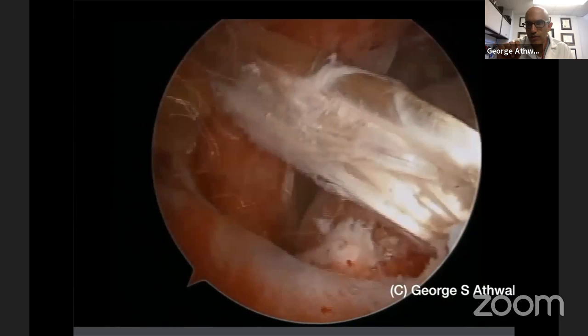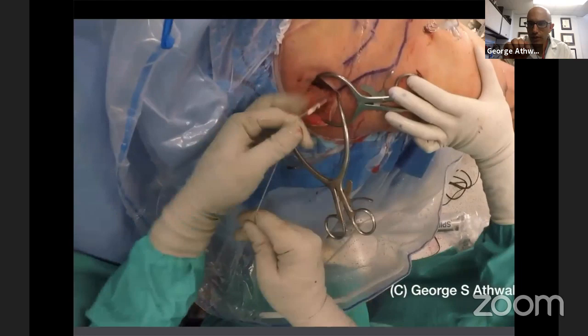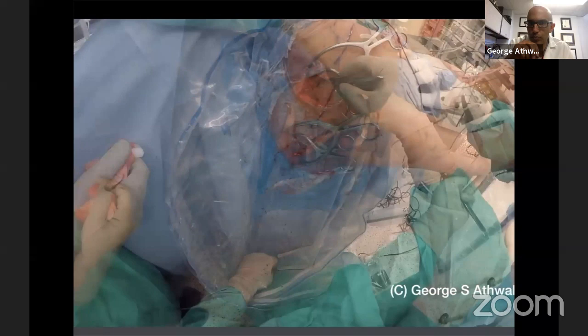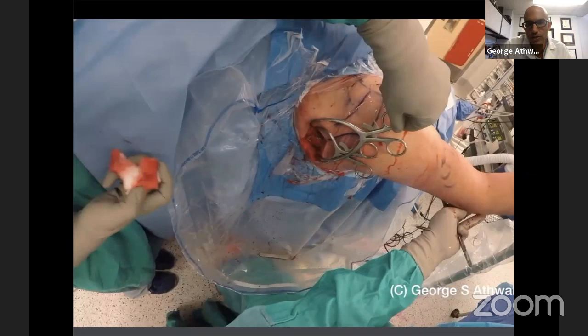And so now what I'll do with the free limb of the graft is tension that and pull on that, place the arm into maximal external rotation and abduction, and secure the free limb back to the lower trapezius. So I've got a looped reconstruction. There you can see the graft right there. So that's the lower trapezius tendon transfer, arthroscopic assisted using a semitendinosus looped graft with a cortical button suspension technique, very similar to an ACL. So my thought is, if we can stabilize the ACL with double looped semitendinosus, we can also do it with a lower trapezius tendon transfer.